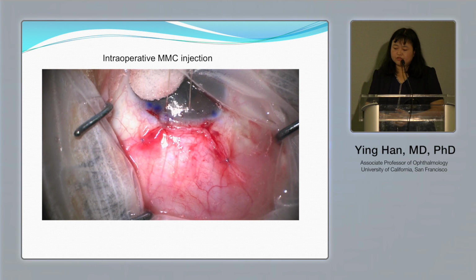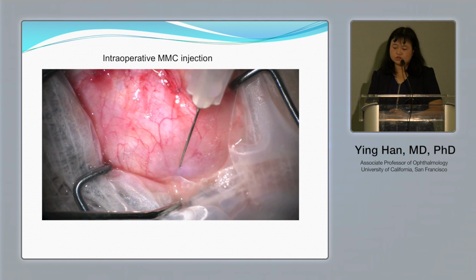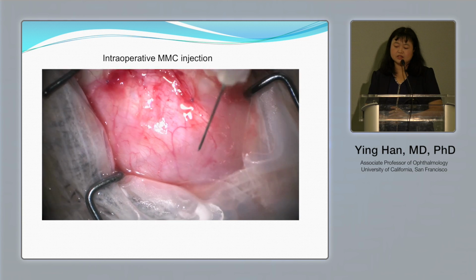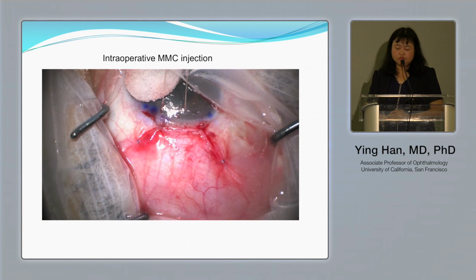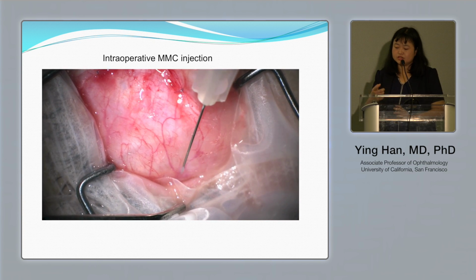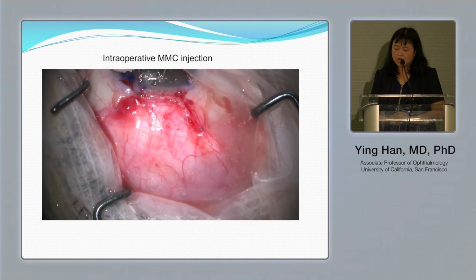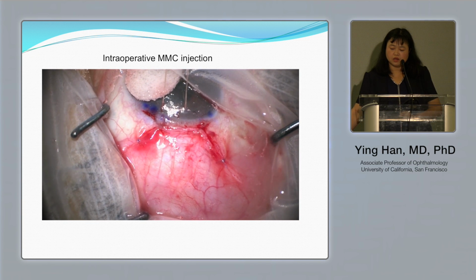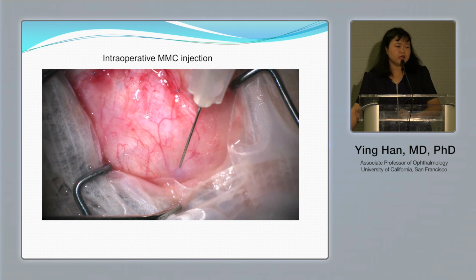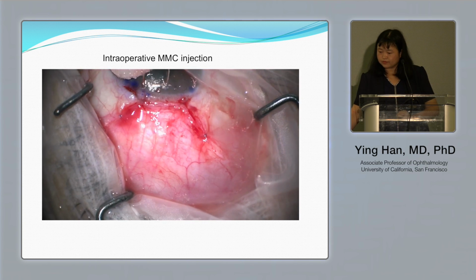So here's the small video. You can do the mitomycin injection either at the beginning of the surgery or after the surgery. Here, by the end of the surgery, we closed everything. We did the mitomycin injection over the plate by the end of the case, right here. And afterwards, we just rinse the eye very well. Depending on whether it's a topical case or block case, if it's a topical case, it would be ideal to give the patient an anesthetic injection first.